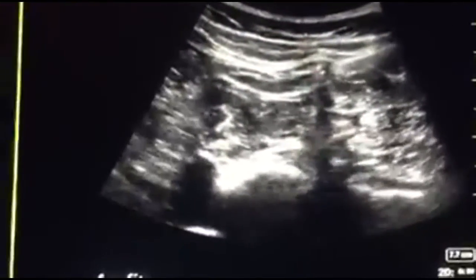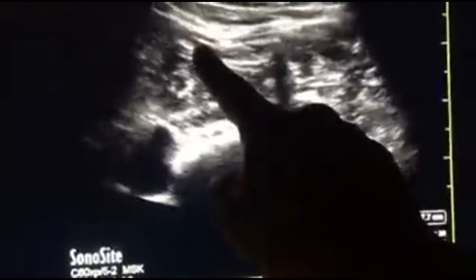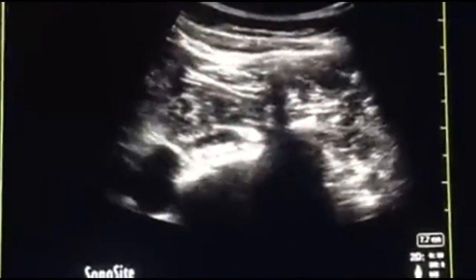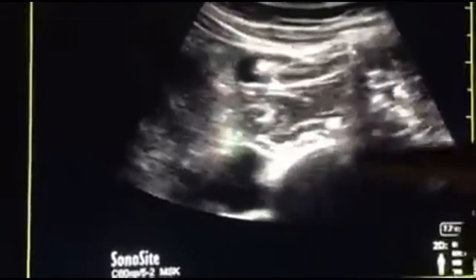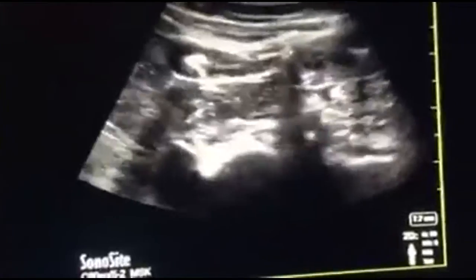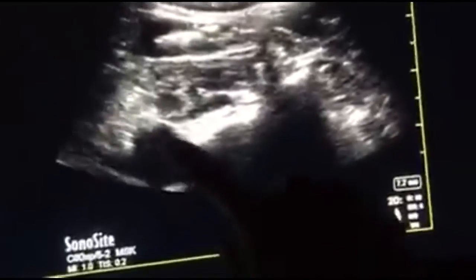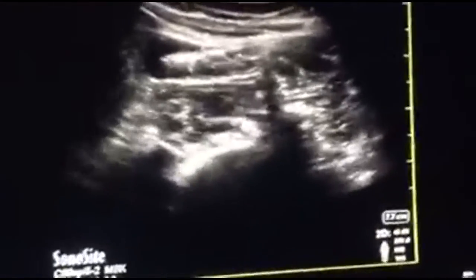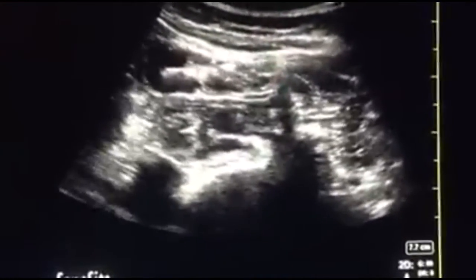To and fro, from the start till end, it's getting repeated. So this is my posterior to anterior approach of quadratus lumborum block. All right. And this is where the liquid, the local anesthetic, is already deposited. Okay. Psoas muscle, quadratus lumborum muscle, transverse process, vertebral body, inferior vena cava or aorta, depending upon the side you are doing. Okay. Let's see how many people are getting it.